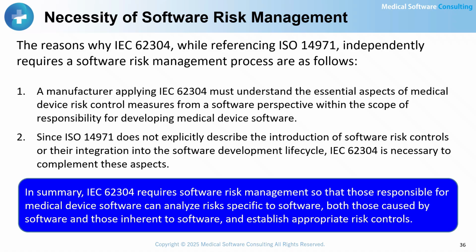First, anyone applying IEC 62304 must understand the software-related requirements of medical device risk control measures within their area of responsibility for software development. Second, ISO 14971 does not clearly describe how software risk controls should be implemented, nor how they should be integrated into the software development lifecycle.